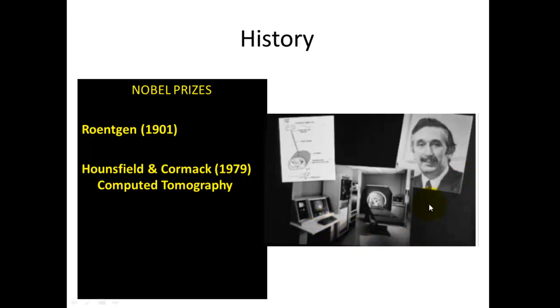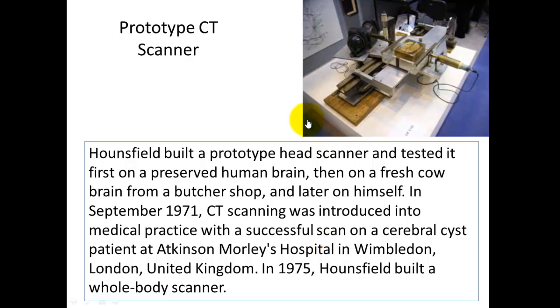If you take a look here, back in the 70s, we had some pretty basic looking computers. The actual prototype scanner didn't even spin around, right? It was tested on a piece of brain matter purchased at a butcher shop in London, and it took a very, very long time to scan this, something that a human person could not possibly be able to sit still for. And I believe the reconstruction took approximately 6 hours. We are down to less than a minute on reconstruction for the most part.